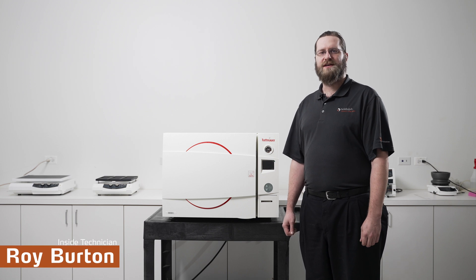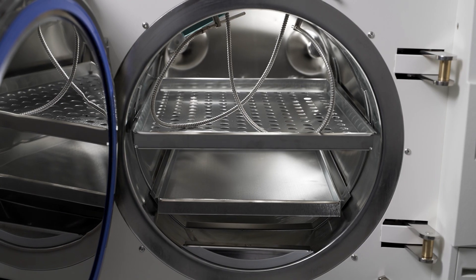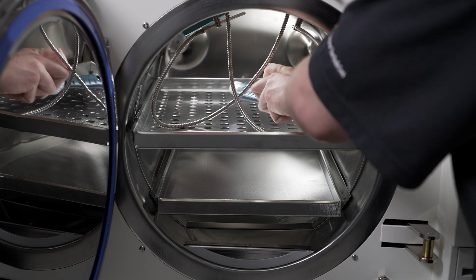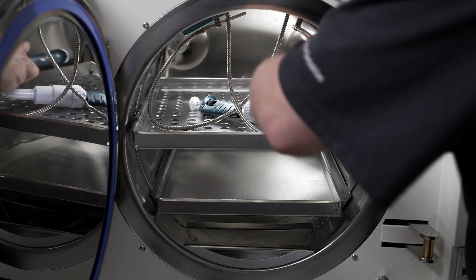Hi, I'm Roy Burton, the inside technician here at Heidolph North America, and I'd like to go over some loading techniques for your autoclave. The first suggestion for loading the autoclave is to make sure that when loading it with unwrapped instruments, they're spaced as far apart as possible to allow for maximum steam circulation.